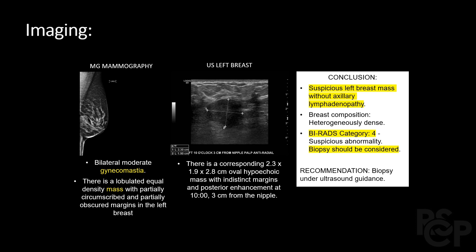Let's jump directly into imaging and look first at the mammogram. You can see just some moderate gynecomastia — the density of this tissue — and also, right in there, this lobulated equal-density mass with partially circumscribed and partially obscured margins.